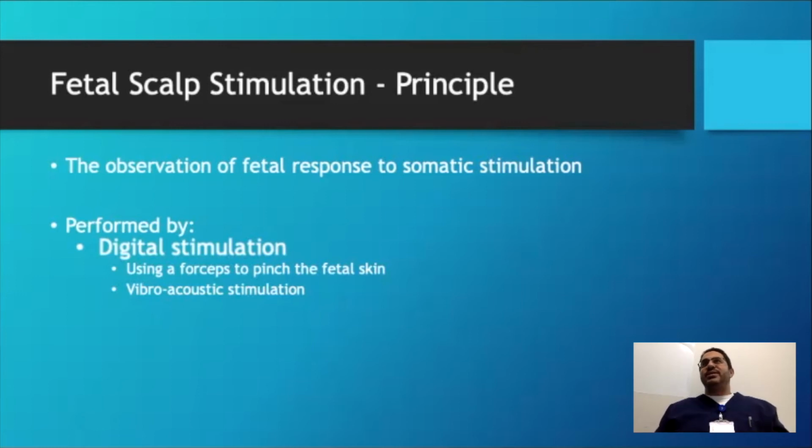And even easier, you can use the ultrasound machine that creates a bit of noise. That's why when women come saying they've had reduced fetal movements and you put them on the CTG machine, the baby's all over the place. It's not because they were lying, it's because you've actually just woken up the baby.